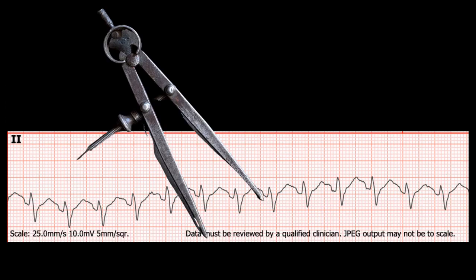You can always, and sometimes you need to, bust out your calipers, but who does that? Although I'm sure somebody carries calipers on their overloaded radio strap or on one of those stupid chest harnesses if you're a flight medic or a flight nurse, but I will shut up because the last time I made fun of a chest rig, someone sent me an extremely angry DM.